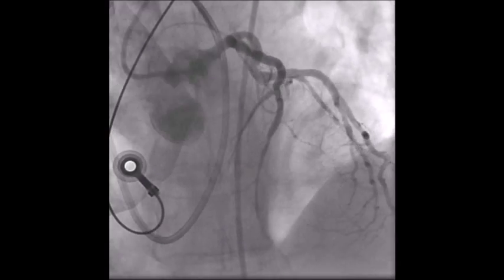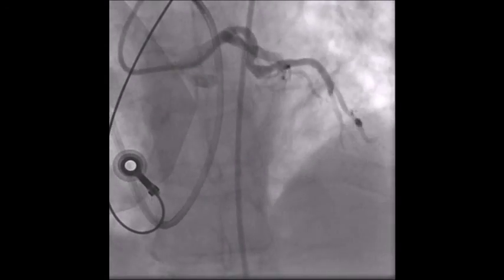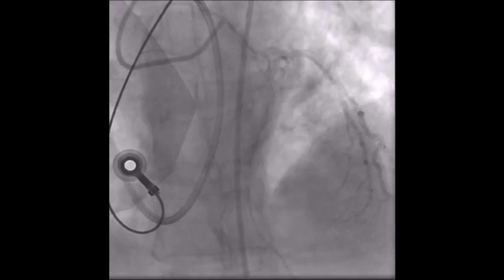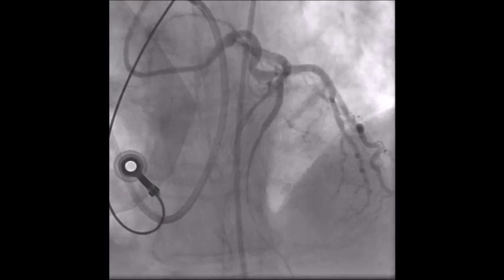Coronary angiogram was done on a different projection, an LAO projection. Note some narrowing of the LAD but no re-occlusion of the recently dilated and angioplastied LAD lesion.